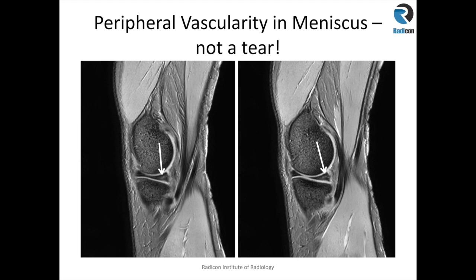Another finding not to confuse with a tear is peripheral vascularity signal change. You see this linear intermediate signal intensity on the images here — it doesn't cross the articular surface and is quite smooth. It may reach the peripheral capsular surface or attachment of the meniscus, but not the articular surface, so on MR characteristics it is not diagnostic of a tear. This tends to appear in younger people and teenagers; I label it as peripheral vascularity and dismiss it. In older populations it may be more rounded with thickening of the meniscus and the signal reaching the articular surface, which can indicate mucoid degeneration.